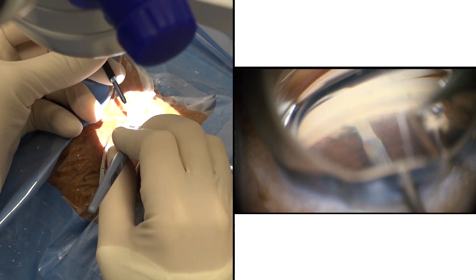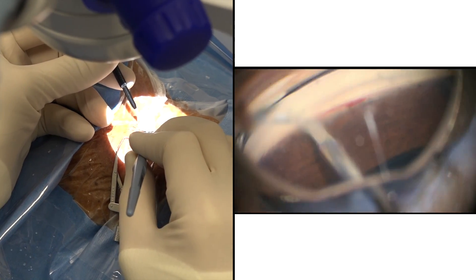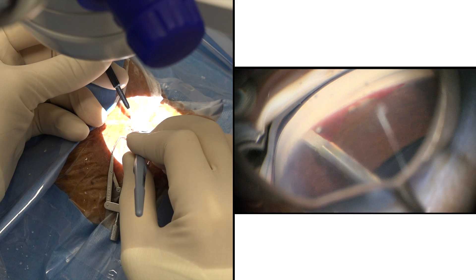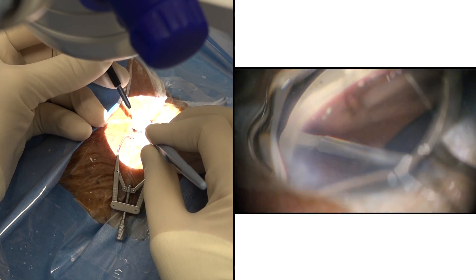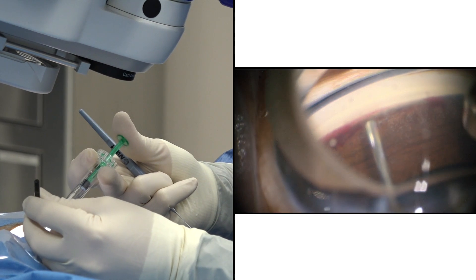This is a so-called inside-out technique where I start really in the middle of my view and go superiorly and then inferiorly. That will leave two strips of trabecular meshwork which can basically be left alone — they do not need to be removed from the eye. They're very benign and they often roll up on themselves, leaving you with a good area of open canal.